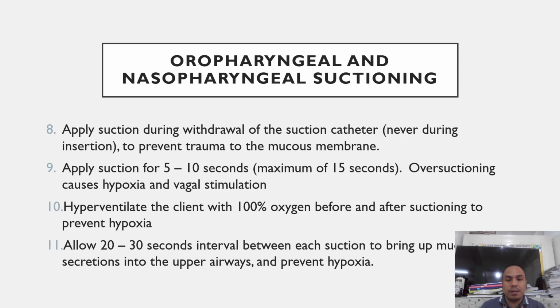Then apply suction during the withdrawal of the suction catheter, never during insertion, to prevent trauma to the mucous membrane. Apply suction for 5 to 10 seconds, with a maximum of 15 seconds. Over-suctioning causes hypoxia and vagal stimulation.